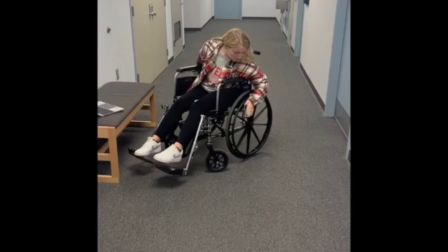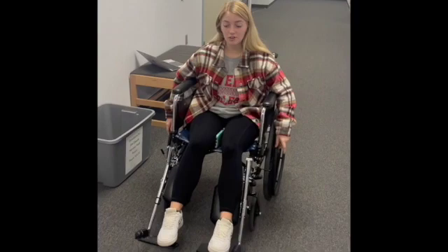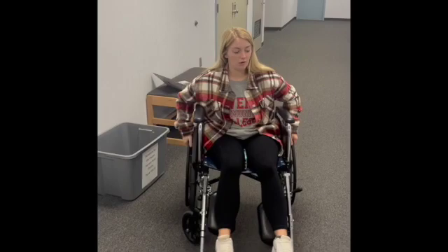My wheelchair is locked — now it's unlocked. When you move, you're going to grab these black hand rims right here. Don't touch the tires because you don't know where they've been. To move forward, you're going to move your hands at the same speed. To turn left, you move your right hand forward and keep your left hand stationary.